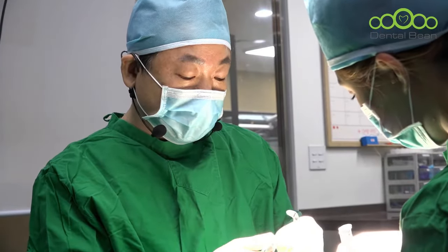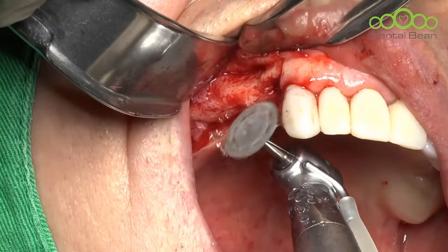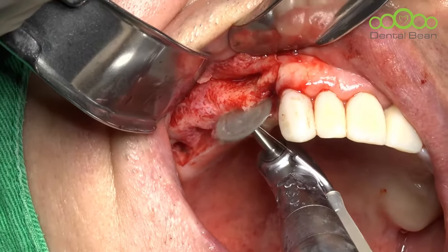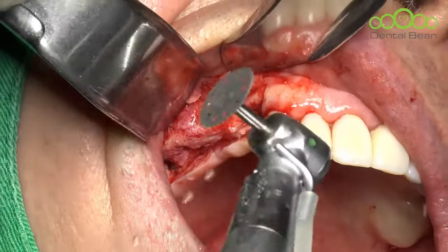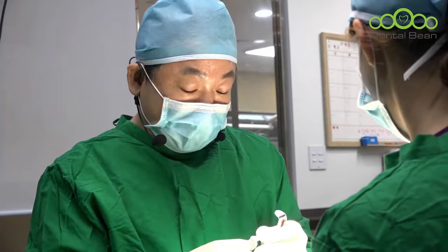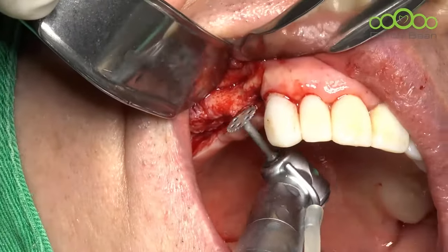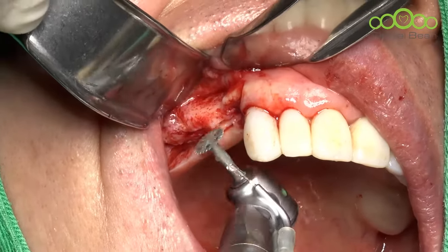The speed is 1500 RPM. It's high speed RPM. Okay. You must carefully protect the soft tissue when you use the micro saw. Okay, done. And when it is near the natural tooth, it's better to use a small size of the saw. Yeah, near the tooth, I will use a very small size of the saw. Okay, done.